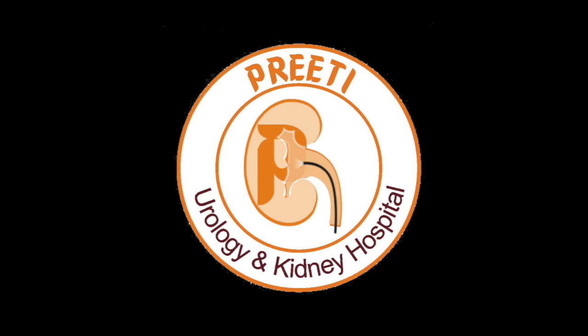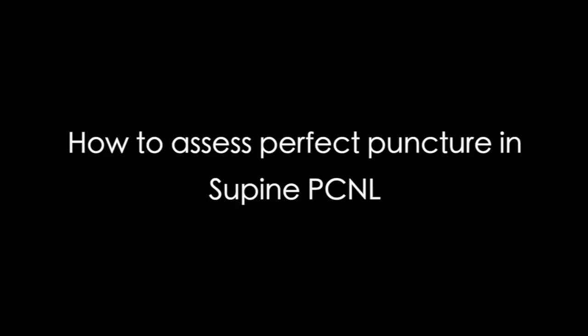We are sharing in this video a case of mal-rotated kidney. I tried posteriorly to puncture the kidney — the kidney was moving and the calyx was moving — but the deformity as well as the kidney movement towards the spine was not there. That's why I want to share this video: a young male with a meaty kidney, and how to assess the perfect puncture, meaning reaching the end of the calyx.